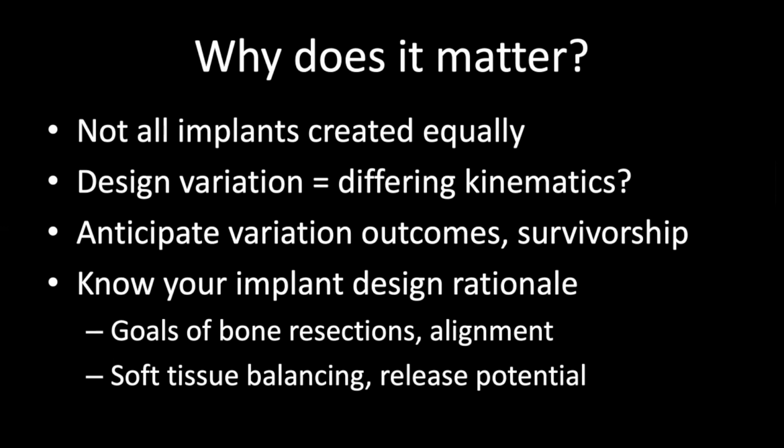So it is important for you to know your implant design rationale and what the goals of the bone resections and alignment are, along with soft tissue balancing and potential releases that will be required to get the knee stable.